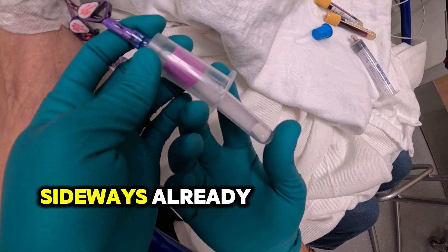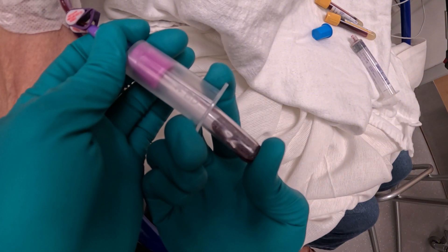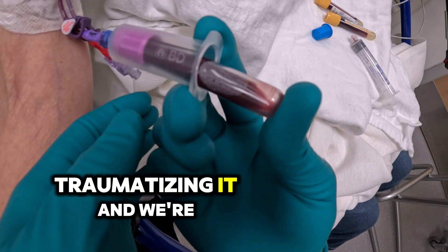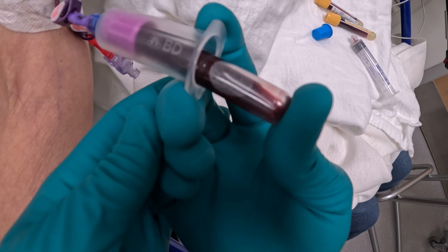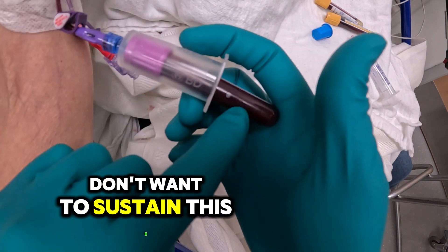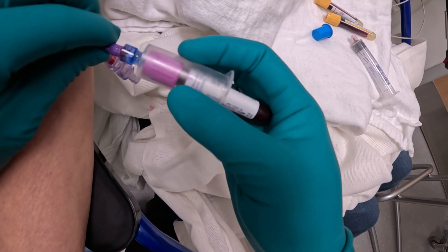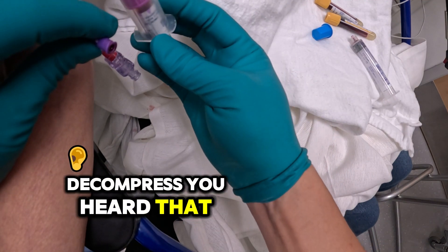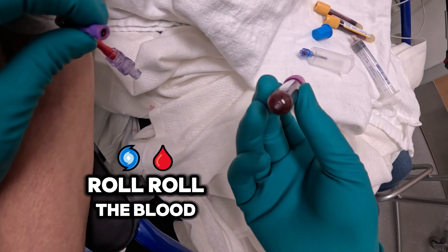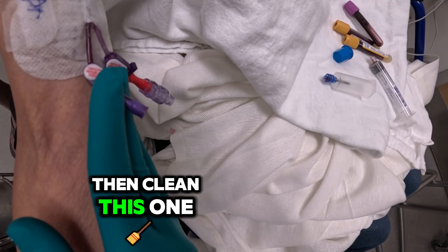We're going to do the same thing for lavender last. Insert it sideways and watch it hit the side — rolling down and not hitting the bottom of the tubing, minimizing trauma. Let that negative pressure normalize. Remember we need to give it more time. If it doesn't fill all the way and you're halfway there, you don't want to sustain this negative pressure — clamp immediately. Decompress — you heard that little suck, that means we're decompressed. Move everything out of the way and roll the blood. Then clean one more time.